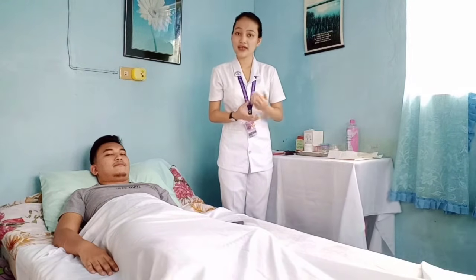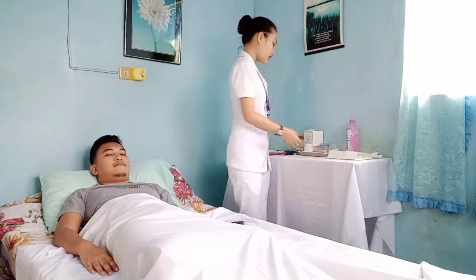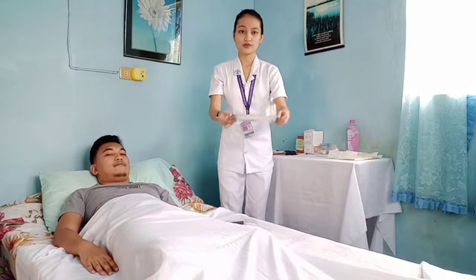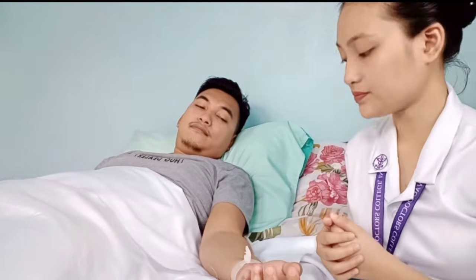Now, arrange the medication card on a hypodermic tray with the corresponding drug. Now, choose an injection site free of lesion or discoloration. Select the site 3 to 4 finger widths below the antecubital space and a hand above the wrist. Position the client's arm so that his elbow and forearm is supported on a flat surface, and then apply clean gloves.